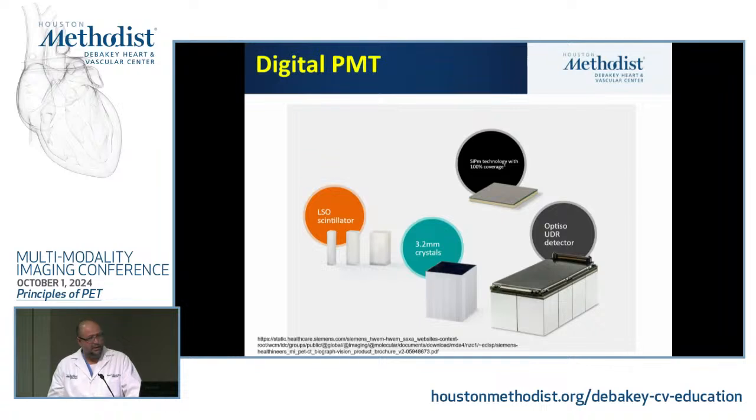So these are the digital PMTs. They started with one vendor, but obviously, as with everything, all vendors now have it, and it's widely available, and the prices obviously are coming down significantly for these.